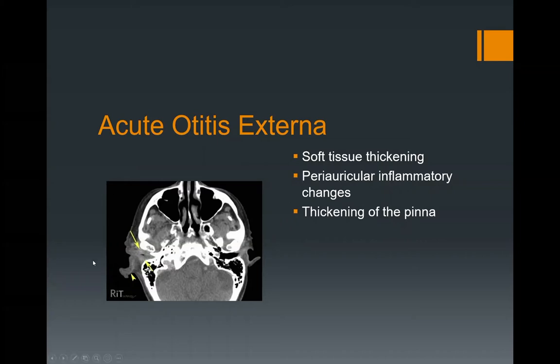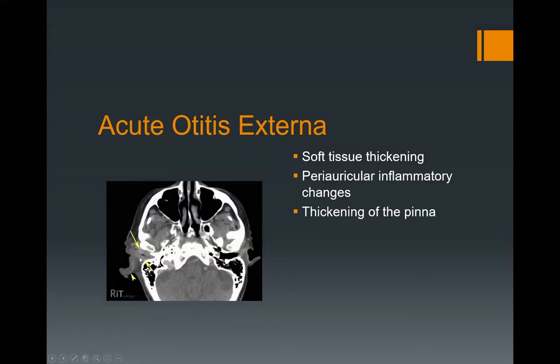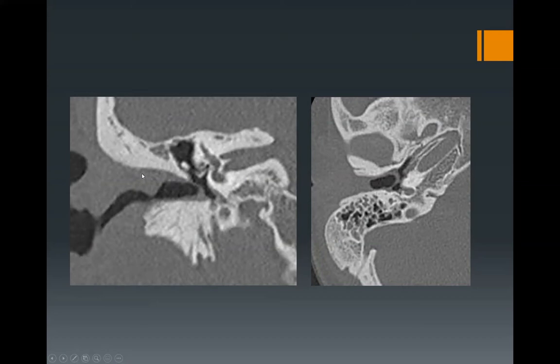Here's an example of a patient who has acute otitis externa. You can see marked narrowing of the external auditory canal itself. Normally you do not see the soft tissue within the EAC because the skin is so thin here. Remember that this is not mucosal thickening because there's no mucosa within the external auditory canal. There's also a chondritis of the cartilaginous portion of the EAC. On CT, typically you will not see bony changes, but you'll see this soft tissue thickening within the EAC itself.